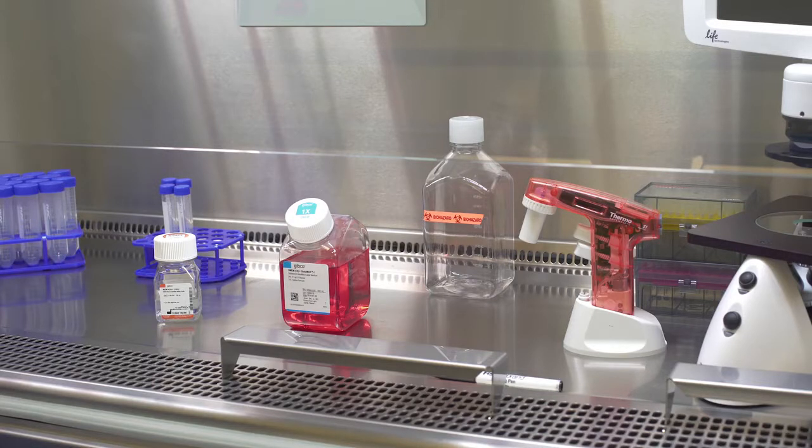Notice how the cell culture hood is set up to make the following actions easier. The pipette aid is on the right side, so you can easily control the pipetting in your right hand. Reagents are in the center back, so you can easily open the bottles and pipette from them. It is very important to have the setup in this manner so you're not crossing your hands or supplies over top of sterile items. We'll now demonstrate the basic technique of handling a pipette and a bottle of medium while aseptically supplementing DMEM with non-essential amino acids.